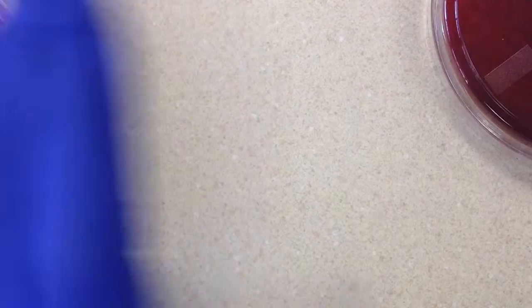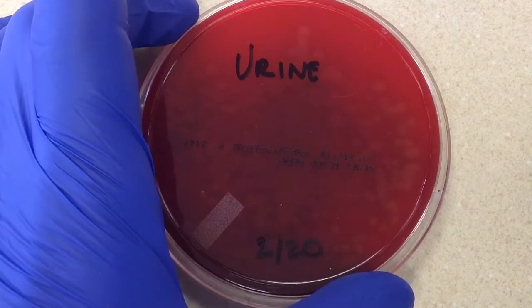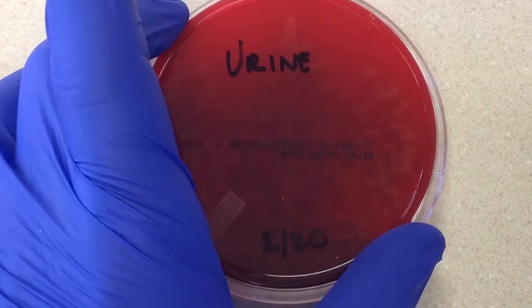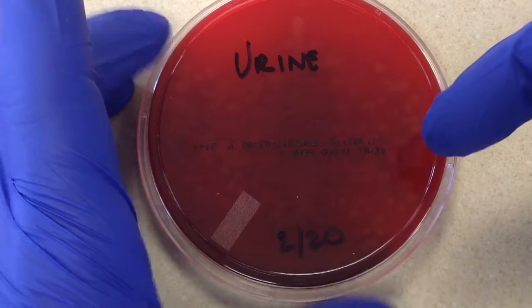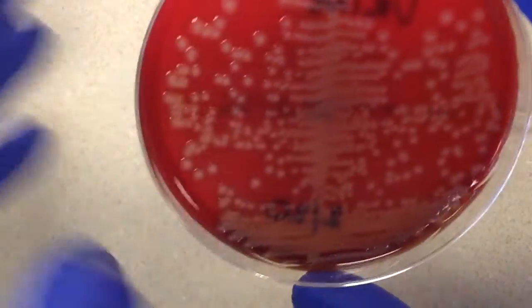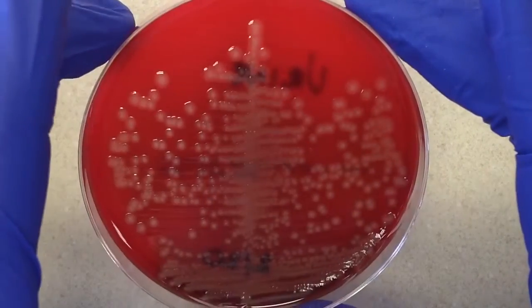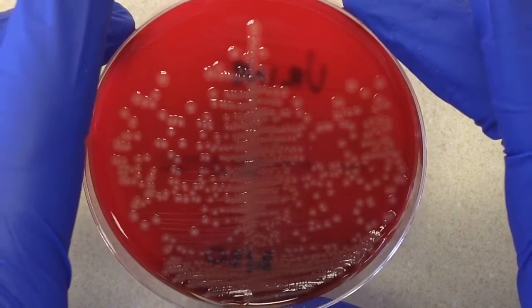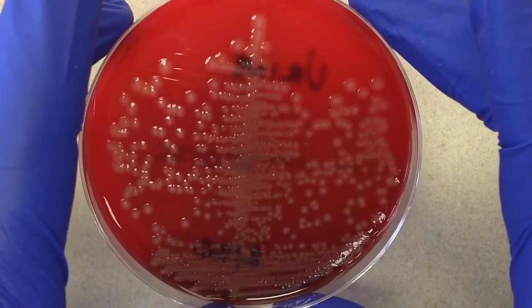The other plate is just a sheep blood plate, and that's the plate we use to count colonies. Your calibrated loop is used on all the plates, but this is the one we use for counting. I'm not going to count all these because there are just too many — this would be greater than 100 colonies, which you would report out as greater than 100,000 CFUs per mL.